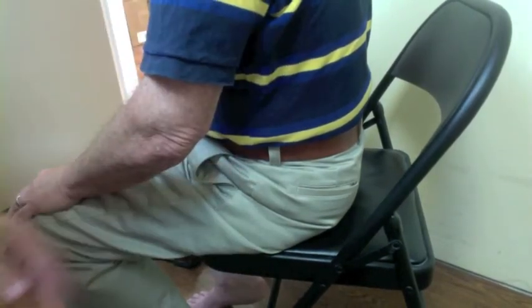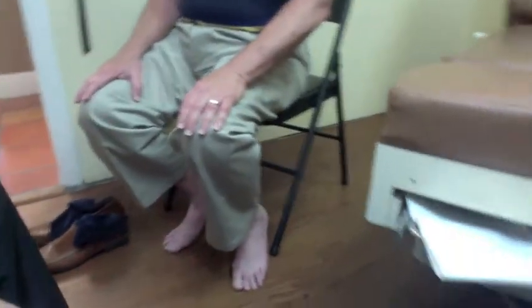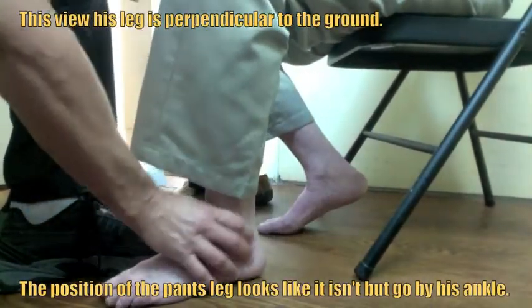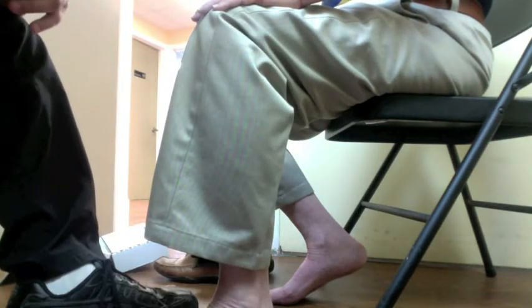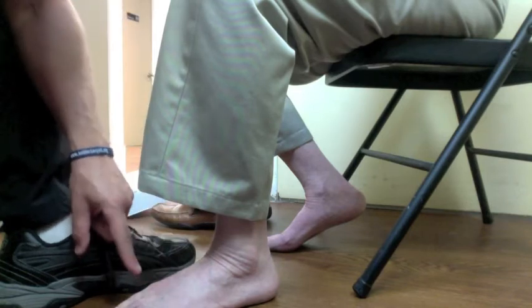This is 90 degrees. While he's in this position, his leg is in a bent position, which is incorrect — we want to show you the correction. So bring your foot forward right there. When you look at his leg compared to the knee, this is 90 degrees here and 90 degrees here, like a corner. Now the back, knee, and ankle are all at 90 degrees. That's the position you want. You can see the other leg is in the wrong position — this is the position you want.